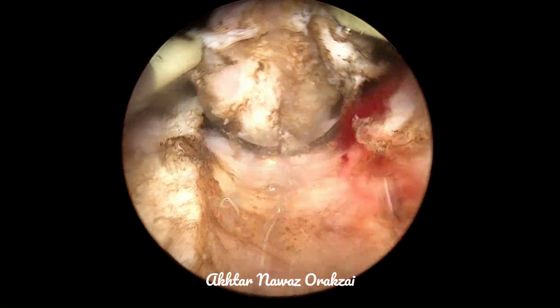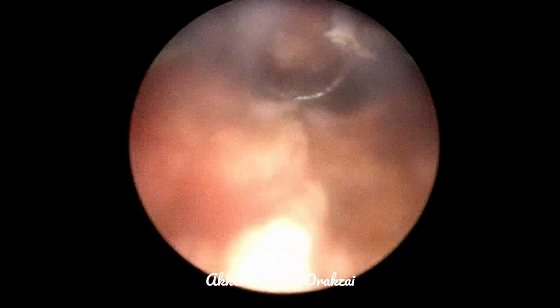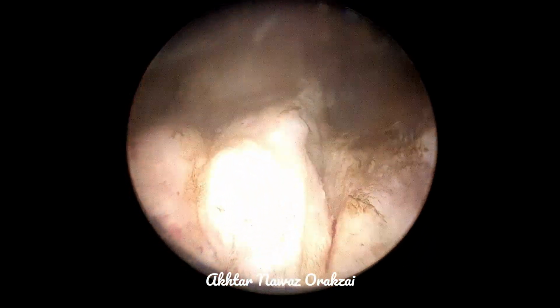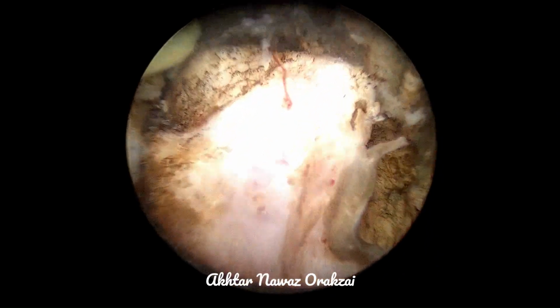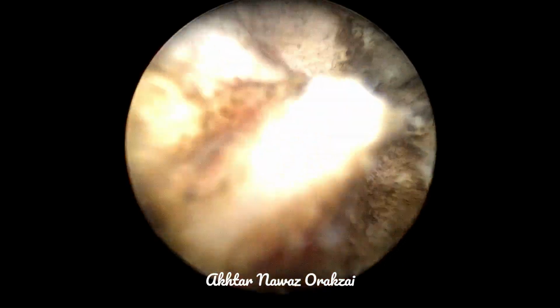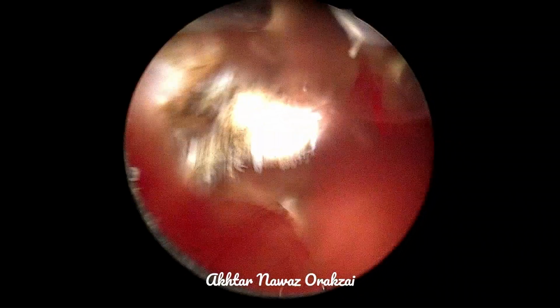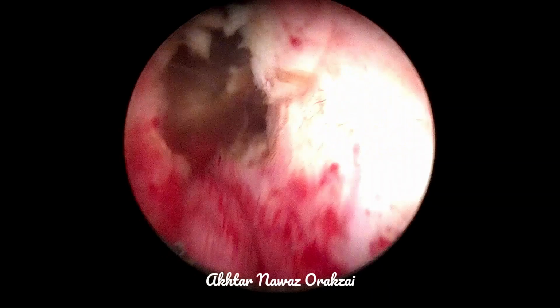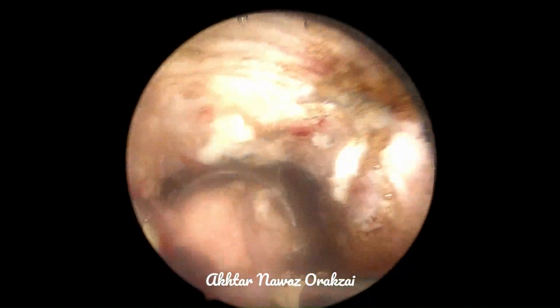Now here you can see that the median lobe has popped up again. These are the vessels in the bladder neck. You can see the transverse fibers or the circular fibers in the bladder neck, and we are trying to preserve them. We are resecting deeper and taking deep chips until a point is reached. That point is actually the small black dots. These small black dots are a sign that we are getting near to the prostatic capsule.